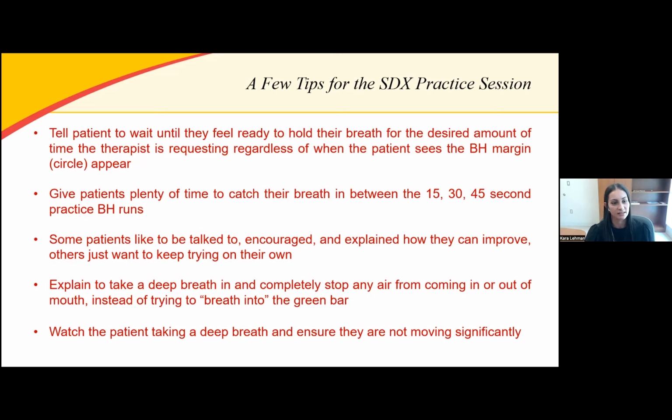So they really want to improve and they really want to get this treatment. If you as the therapist can just be watching and encouraging them, if for some reason the patient is not passing the practice session, just make sure you're watching them and you can give them advice. For example, maybe they don't have a tight seal with their lips around the mouthpiece. So you want to make sure that you can offer them some way that they can master this technology.